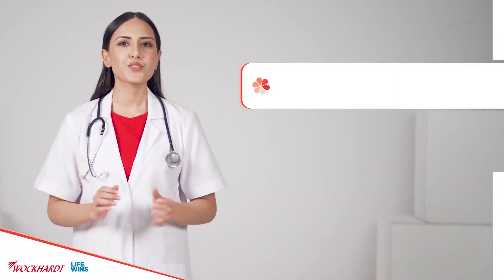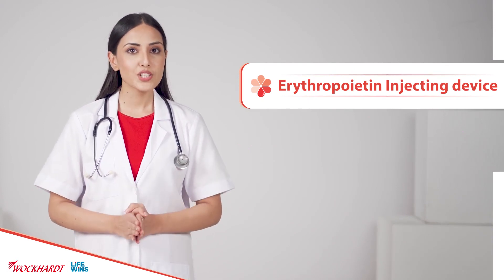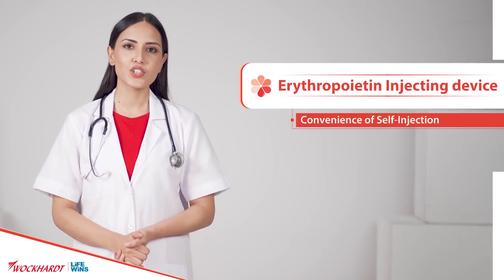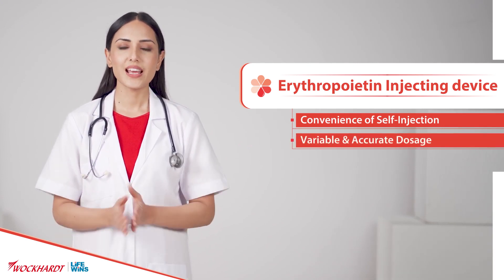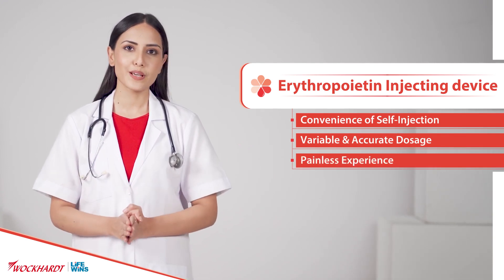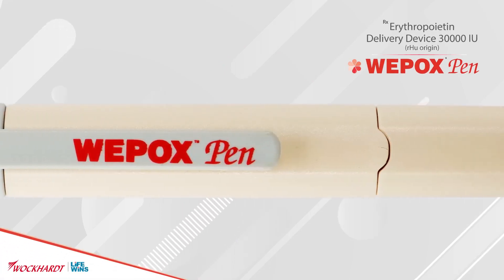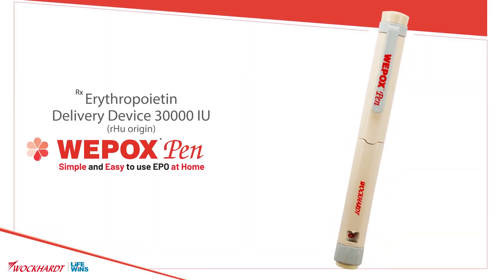Introducing for the first time in India the only erythropoietin injecting device engineered for the patient's convenience of self-injection, variable and accurate dosage, and drug delivery along with a painless experience to all CKD patients on EPO therapy. Introducing Wepox Pen 30,000 IU — the number one brand of erythropoietin in India — simple and easy to use EPO at home.